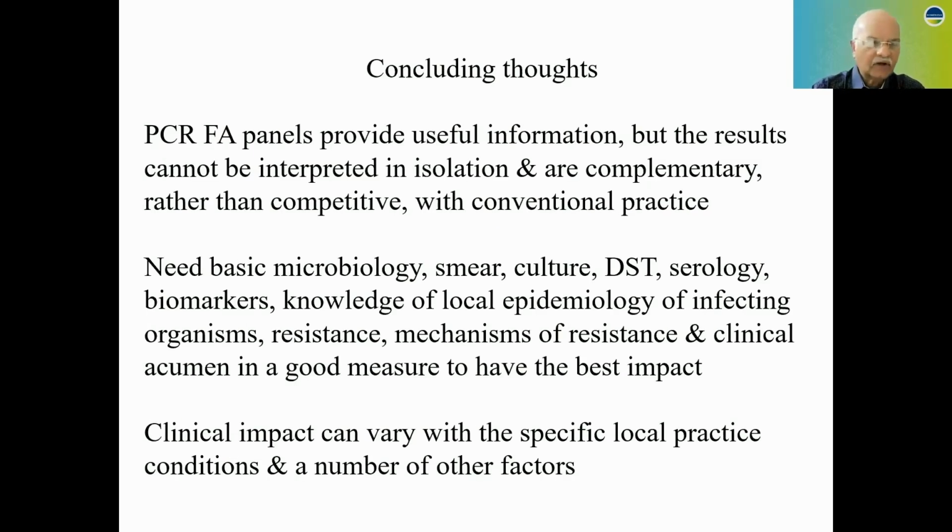So some of my concluding thoughts. So we have this PCR FilmArray panel. It does provide very, very useful information, but the results can't be interpreted in isolation. They are complementary, friends. They are not competitive with conventional practice.